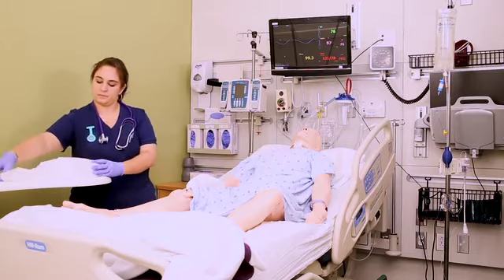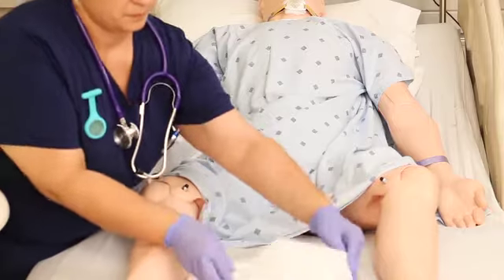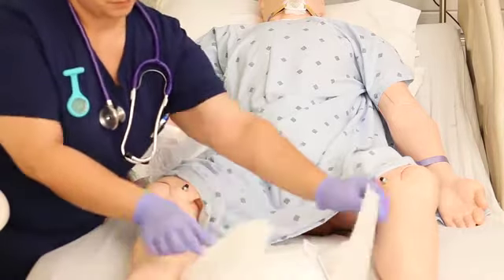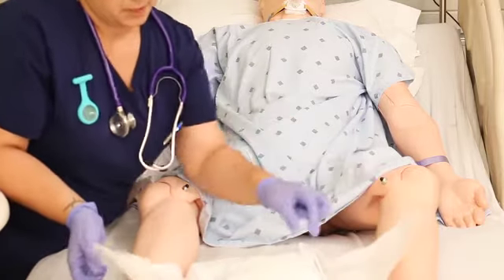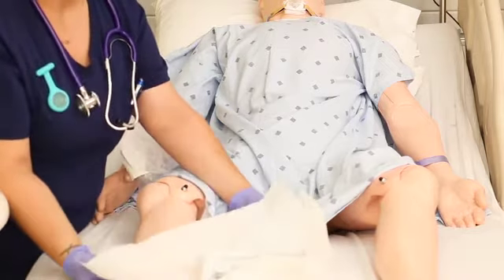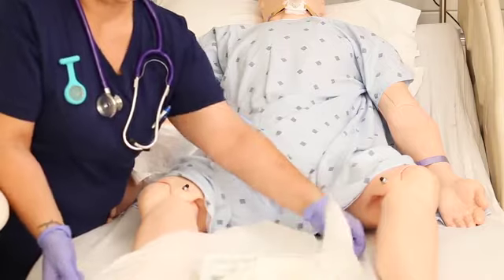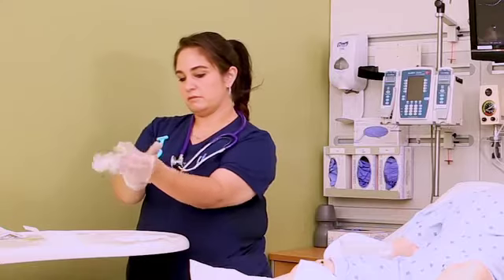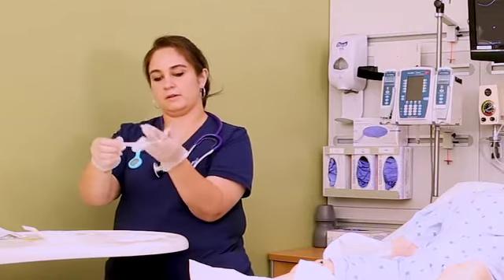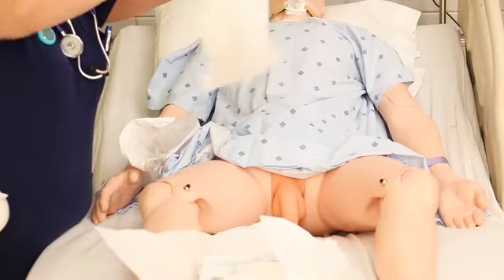Pick up the kit from the bottom and place it between the patient's legs, reminding them not to move their legs or touch the kit. Remember to only touch the outside one inch of any sterile package. Once you have it open, grab the sterile gloves from the top of the kit and put them on.